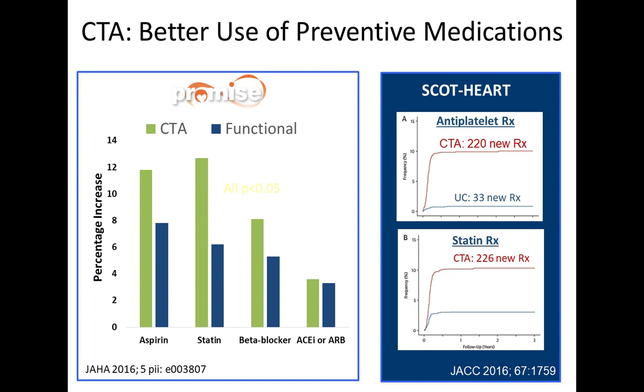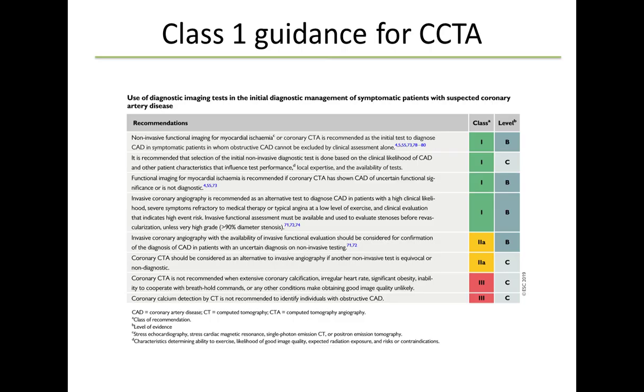So I think all of that evidence has really allowed us the opportunity as a field to understand that the value of CT is really in its diagnosis, its prognosis, and really guiding medical management. A very powerful tool that has led to the European Society of Cardiology to put forward a Class 1 guidance for the use of CCTA in a stable setting.